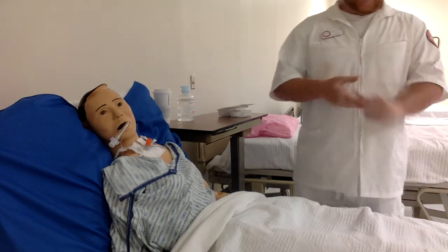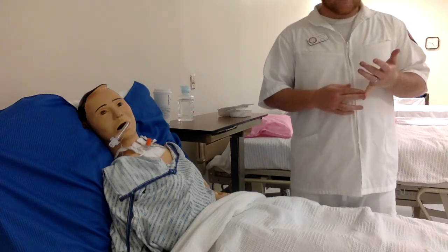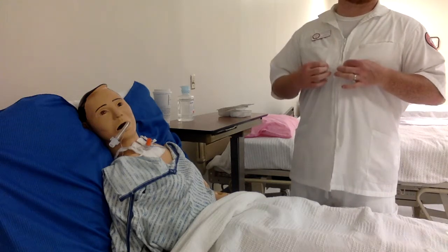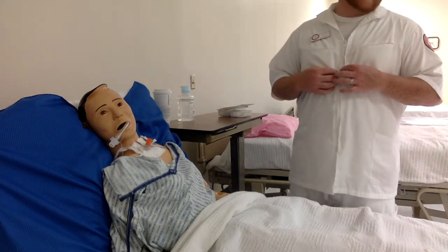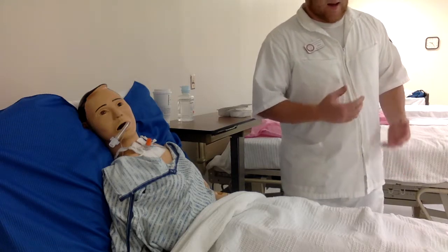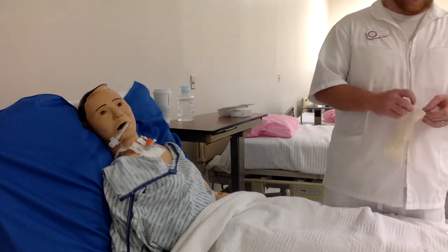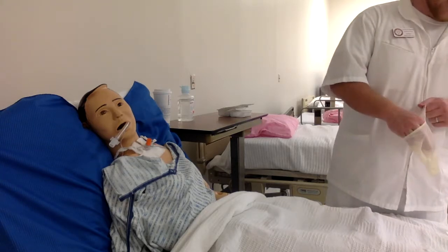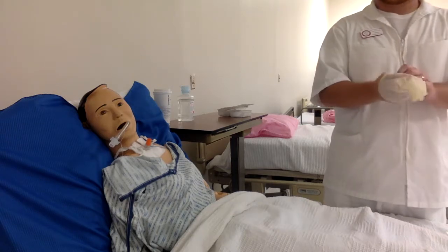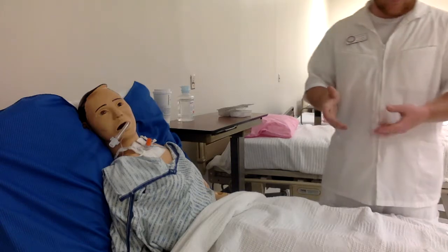Wash your hands. You want to make sure you have PPE, which includes a mask and a gown. For the purpose of this video I do not have a gown or mask, but I do have gloves. So I'm going to put on some clean gloves.